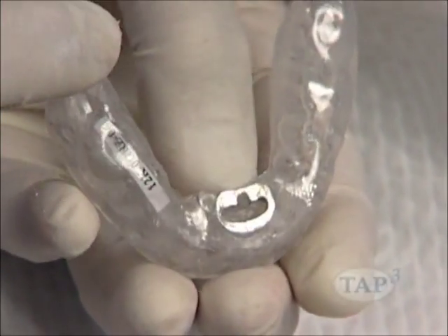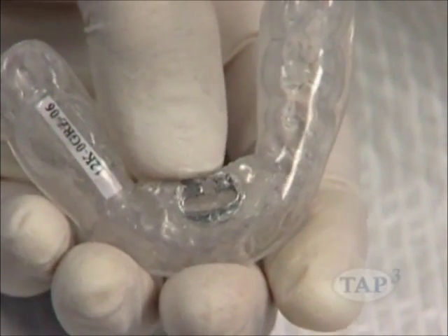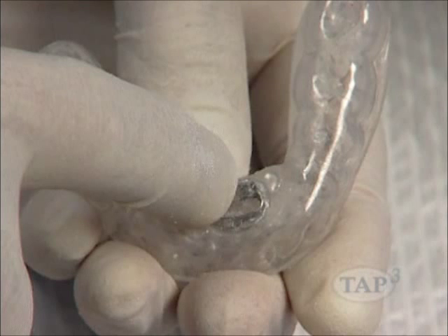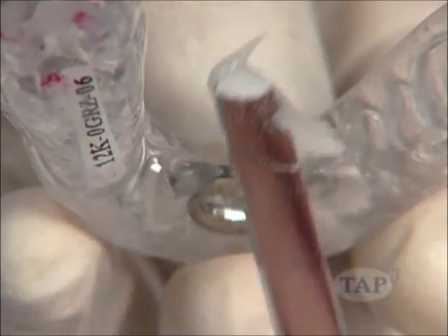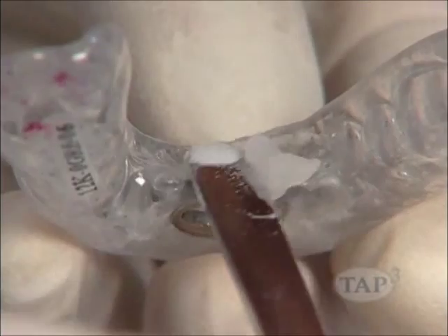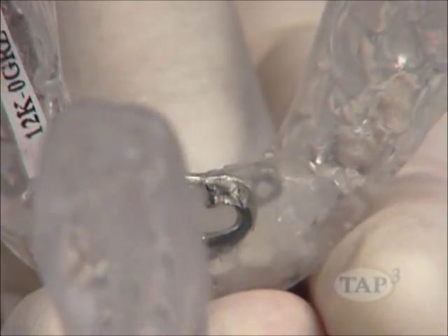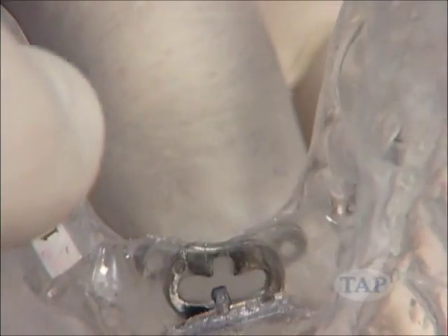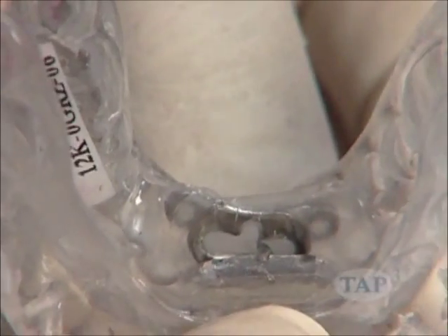If you want to prevent the patient from disengaging the trays while in the mouth, the notch in the socket on the lower tray can be filled with acrylic. Mix cold cure acrylic. Place the acrylic in the slot and under the lower plate. Hook the trays together and slide the hook from side to side to clear the slot. Be sure not to clear any of the acrylic from the notch.